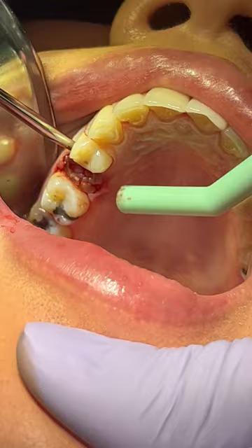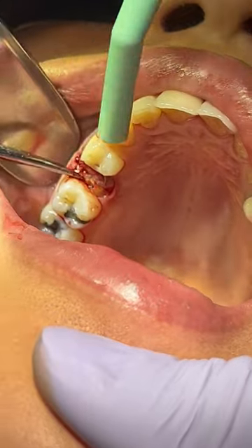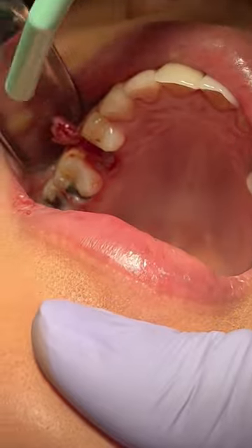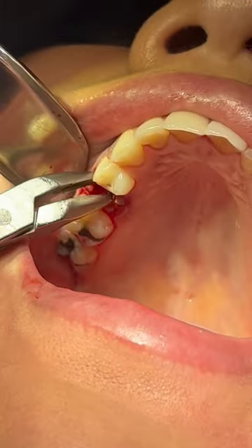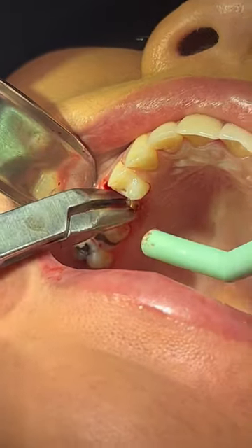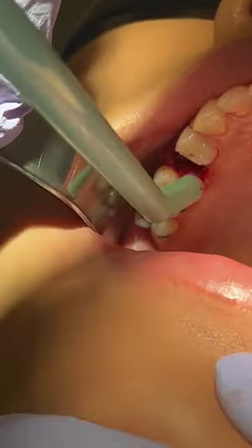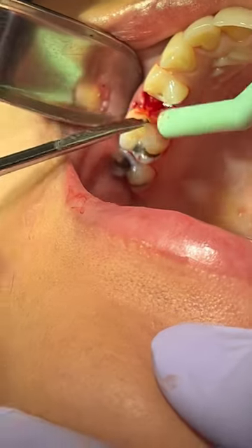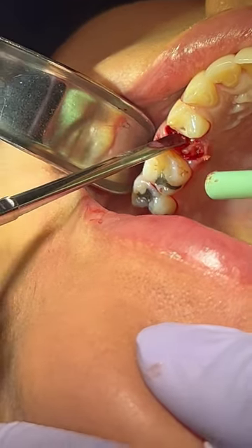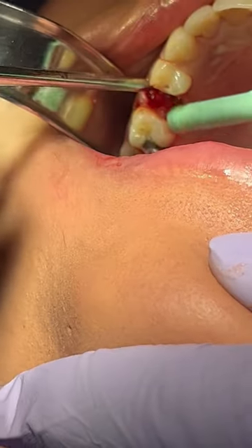The luxators are meant to be used within the PDL space — pretty much going parallel to the tooth, if not at a little more than a 45-degree angle. You want to try to establish a purchase point. Here's where I made a little mistake: I started using the luxators without getting rid of the granulation tissue first. You want to be able to see what you're doing. So I went back in with my rongeurs and removed all the granulation tissue on the surface, broken down pieces of tissue, and broken down pieces of decayed tooth structure.